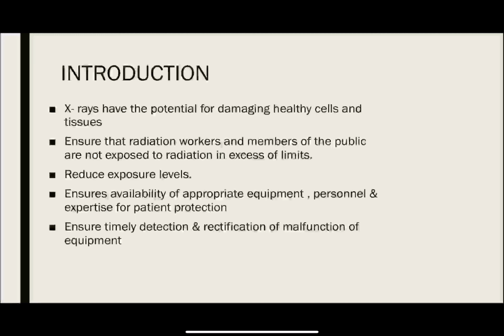Workers in diagnostic radiology are exposed exclusively to external irradiation, like the exposures of radiographers. If they work according to elementary rules of radiological protection, it will be very low. So we have to ensure timely detection and rectification of malfunction of the equipment.